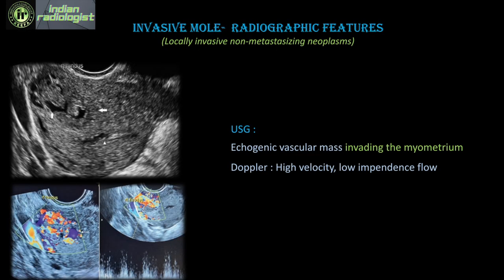Coming to the invasive mole, it is locally invasive. When you see heterogeneous cystic areas, you must ascertain whether it is invading the myometrium. Look for focal myometrial thinning and the margins of the lesion, and confirm that the flow is not invading into the myometrium. There will again be high velocity and low impedance flow. Whenever we come across gestational trophoblastic disease, we have to look for features of myometrial invasion.